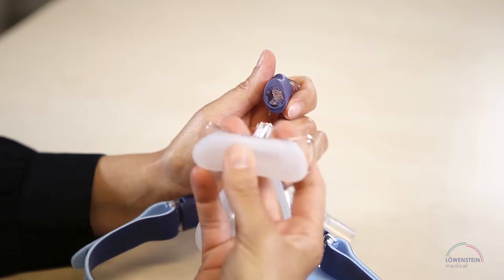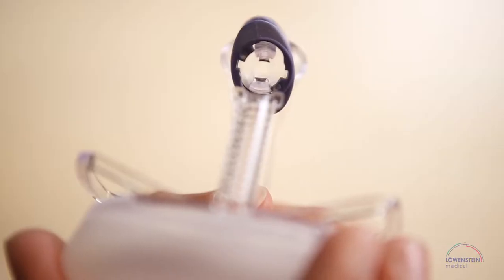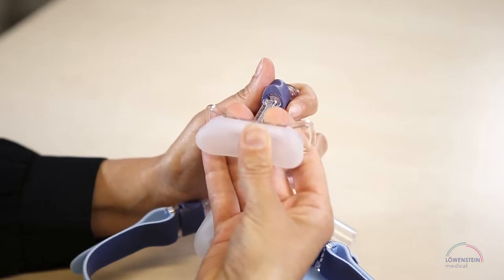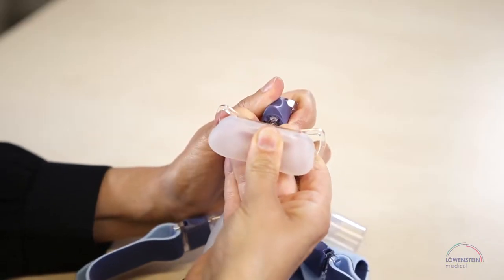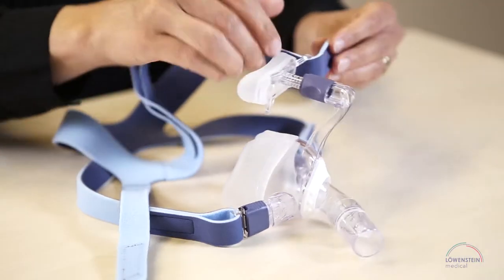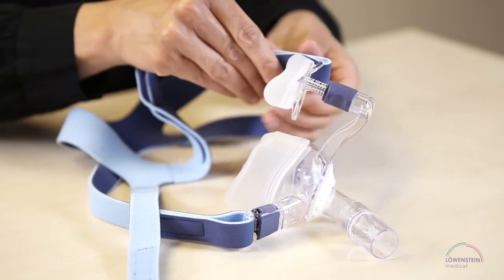Leave the blue element in the open position. Insert the forehead support in the opening and apply a bit of pressure to attach it to the mask. Close the blue element. Thread the straps through the slits and close the hook and loop tabs.